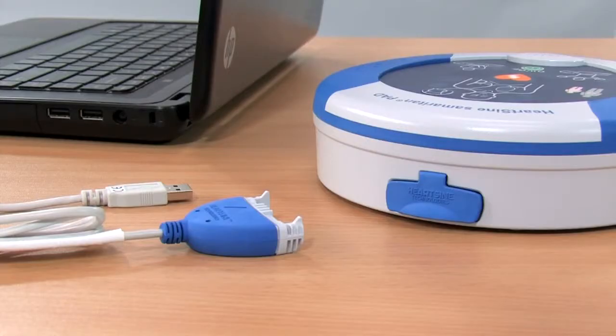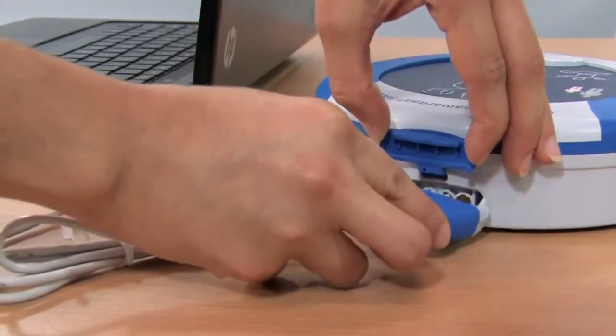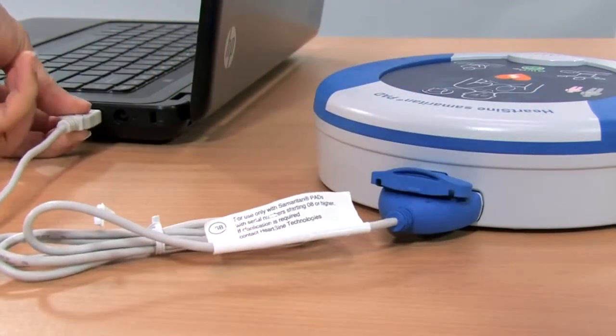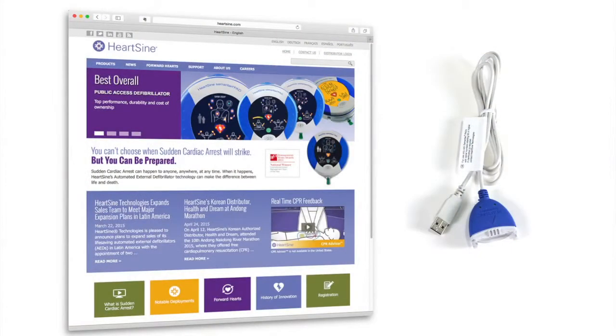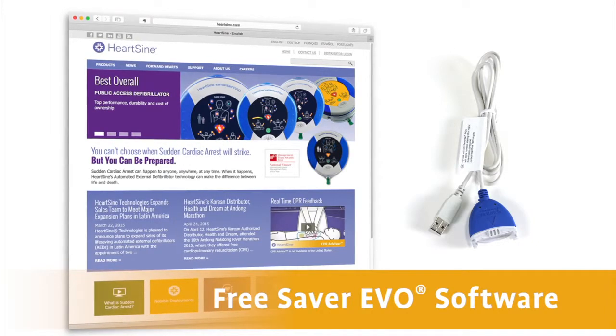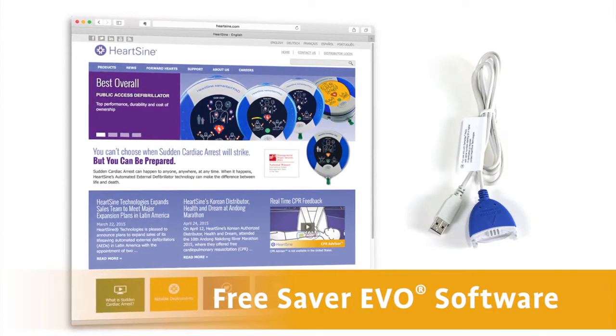The Samaritan PAD logs up to 90 minutes of heart rate information after use. A physician may want the event data from the PAD to make treatment decisions. To download the event data, use the data cable. After downloading the information, please erase the data from memory. Instructions on how to download the Saver Evo software are included in the user's manual and are on HeartSine's website, www.heartsine.com.